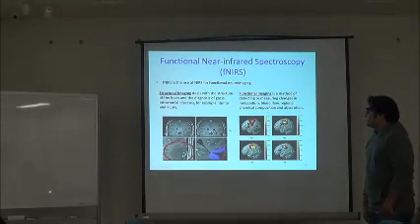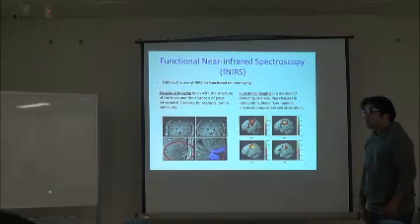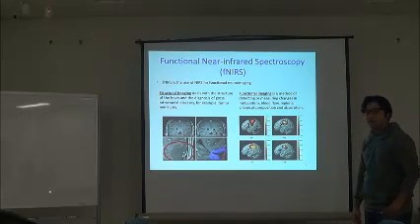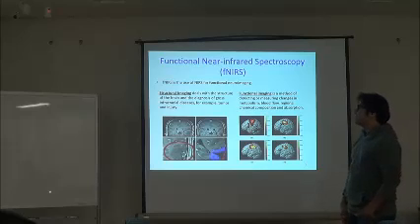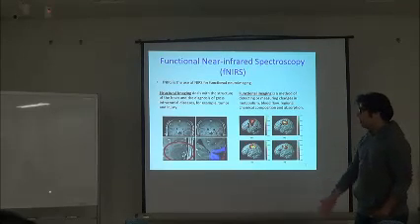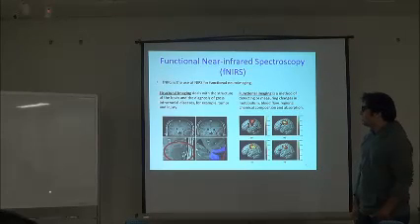Now, what is functional near-infrared spectroscopy? Using near-infrared waves for spectroscopy means it's near-infrared spectroscopy, but the functional part is that we have two kinds of imaging techniques: structural imaging and functional imaging. Structural imaging deals with the structure of the brain or any other body part, and the diagnosis of gross intracranial diseases. Intracranial means within the brain, for example tumor and injury.